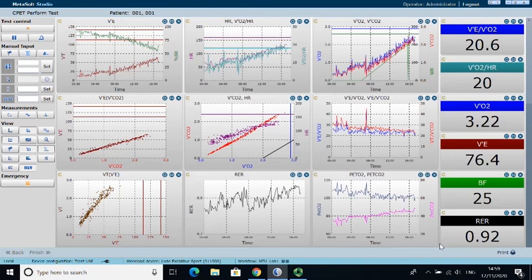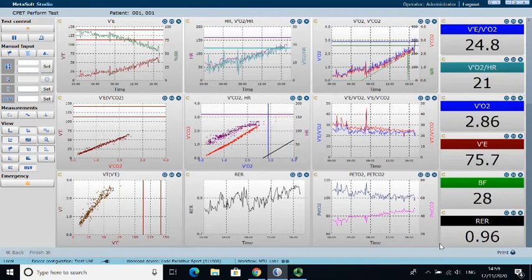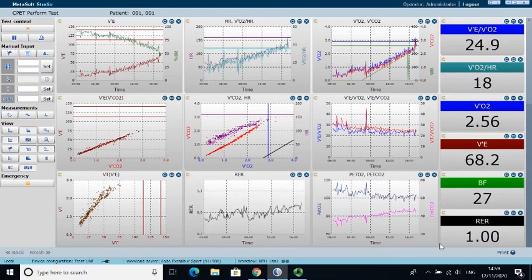Same for oxygen consumption. I'd love you to get in the habit of really thinking, what do we expect to see in a young, healthy male for oxygen consumption in litres per minute and then mils per kilogram per minute. I have an expectation in my head when I come into these tests, and I'm always looking to see whether they exceed my expectations or not, and then I can use that to improve my idea of what I should expect in someone. And when we were in the labs, there were largely what I thought, but there were a few people that achieved a little bit more and a few people that achieved a little bit less.